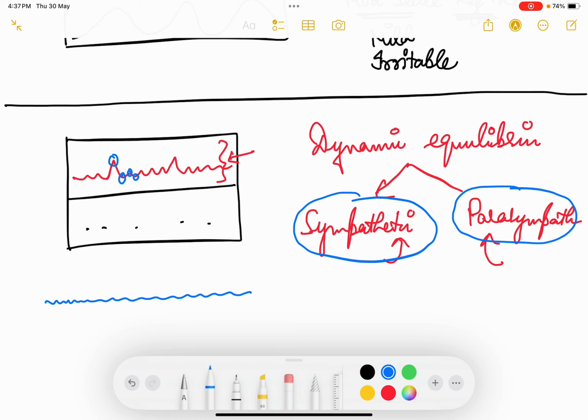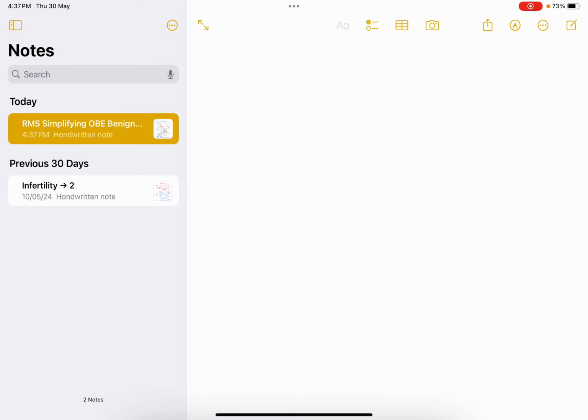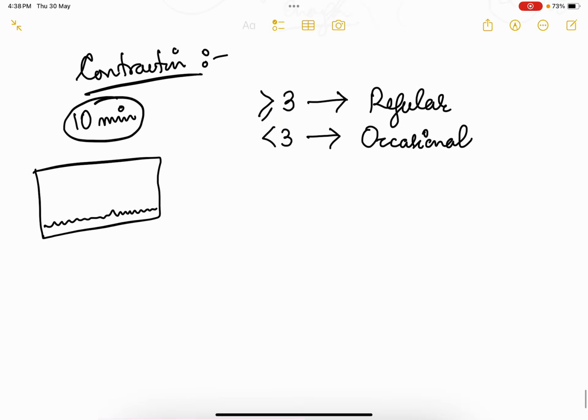The heart rate will be almost a straight line. But in babies where the sympathetic and parasympathetic systems are well developed, the variability will be high. So it is very important to know whether variability is high or not, and that is better understood based on your baby's maturity.